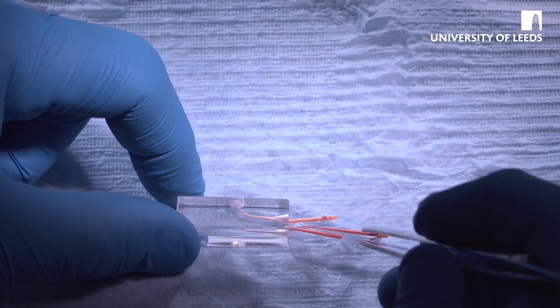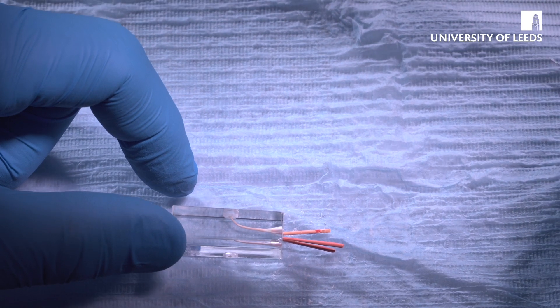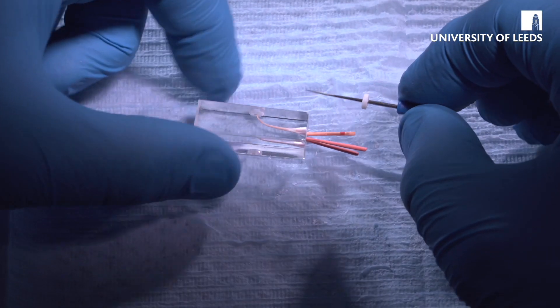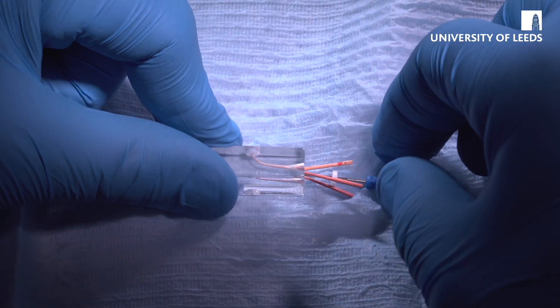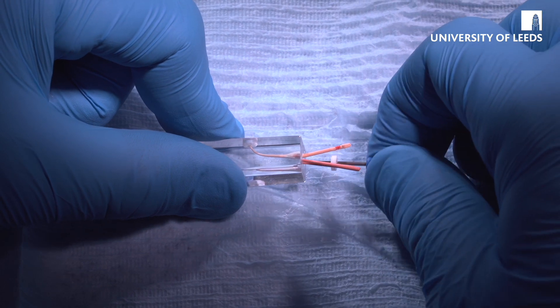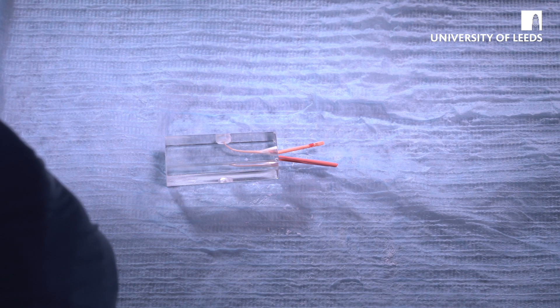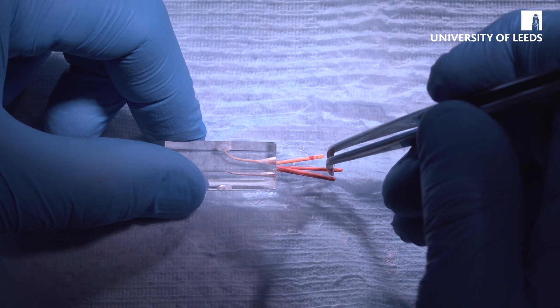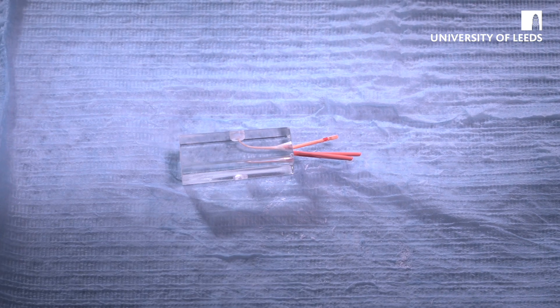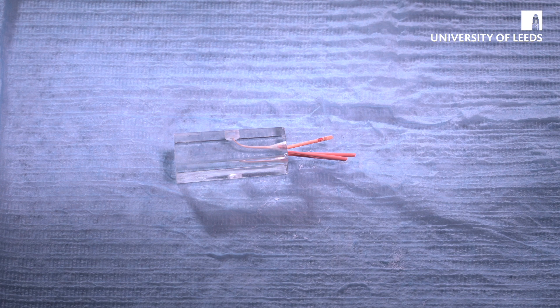Same again — get another auxiliary cone or accessory cone, apply sealer, and then place into the canal. You'll probably get two or three accessory cones in a tooth that's been prepared like this. Hold for two or three seconds and then pull out. Last one going in — and that's fine.